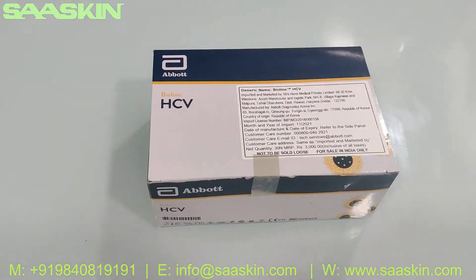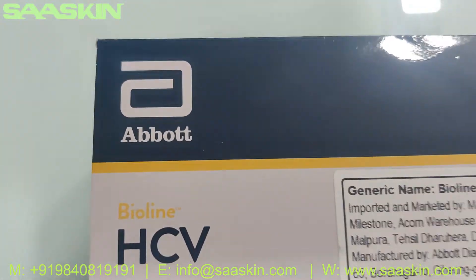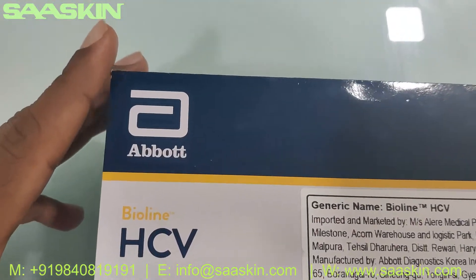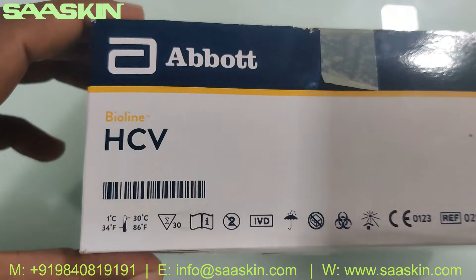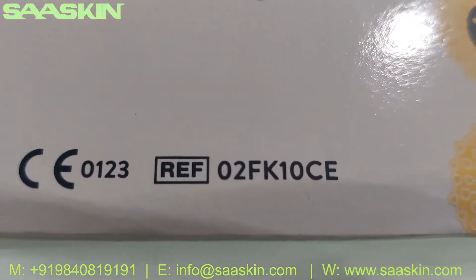Hello everybody. Today we are going to see the unboxing of an Abbott Bioline HCV test kit — hepatitis C virus test kit. This is how the box looks like. It's a completely CIVD certified product and this is the reference part number.